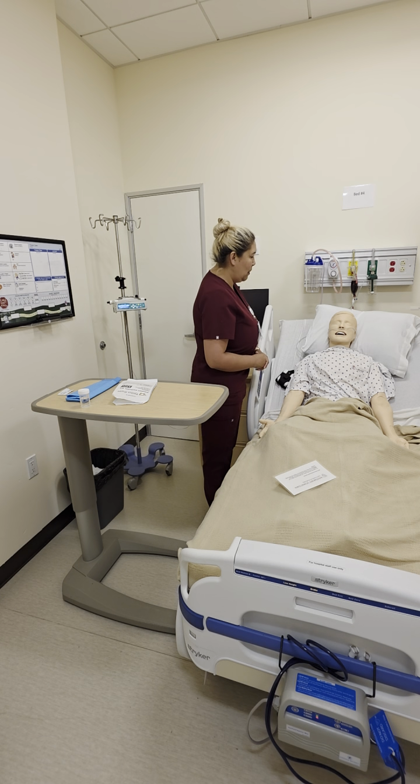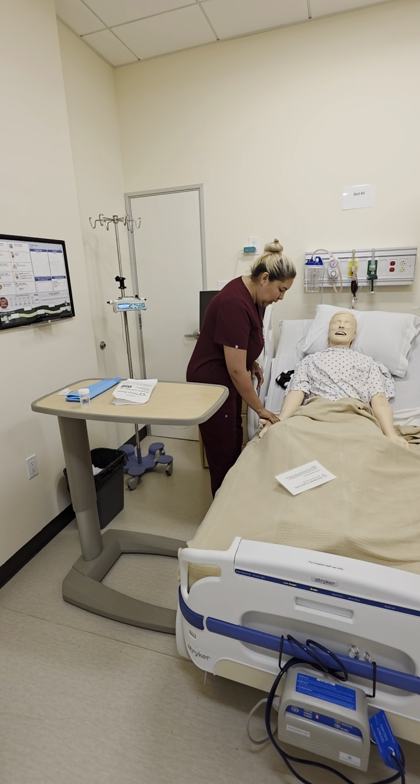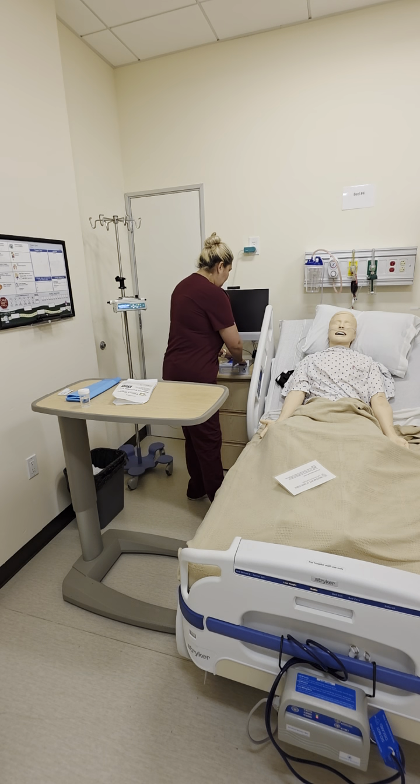Hello, Mr. Smith. My name is Sylvia. I'm going to be performing the nasal suctioning. Can you please provide your name and date of birth for me? Mr. Smith, 10/20/1965. Okay, and I'm going to explain the procedure for my patient and ask if he has any questions.